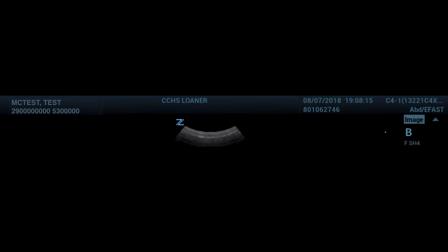We are now ready to scan. The screen will now have the patient information, the users for the study and the date, and the probe and preset that is in current use.